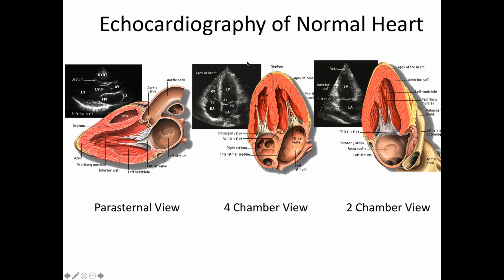And then if you put the transducer below the patient's rib cage towards their feet and look up towards the heart, you can get a horseshoe looking object, which is this. This is the left ventricle. And then the two atrial chambers are back here, the right ventricle's here, and you can see the valves.